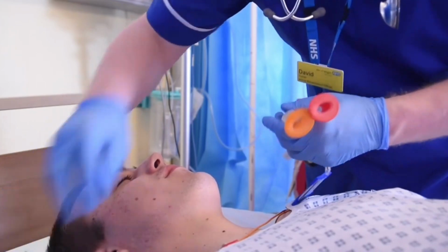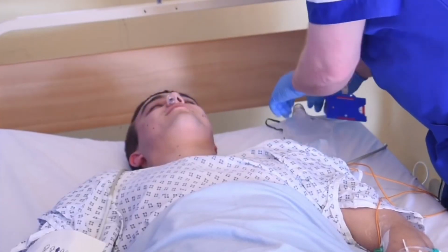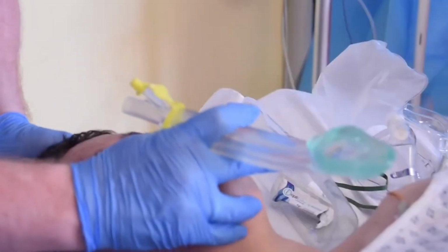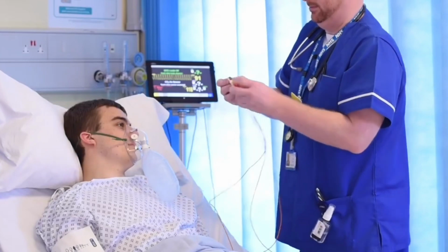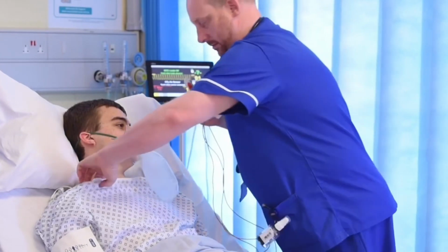At all times, assess and reassess all maneuvers and adjuncts for efficacy. If they do not appear to be providing the support required, return to the last combination that did work and reassess. If the interventions performed to support A and B are working, proceed with the rest of the ABCDE assessment and hand over your findings to the emergency team as they arrive.